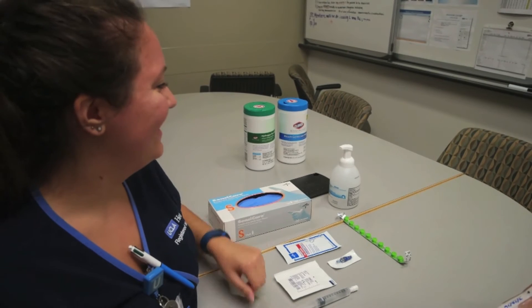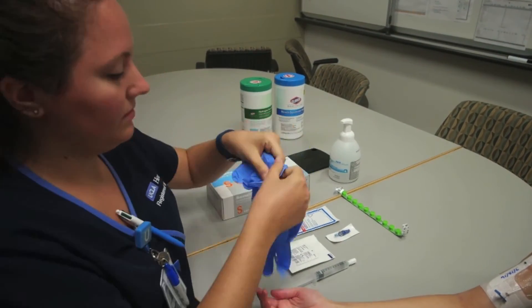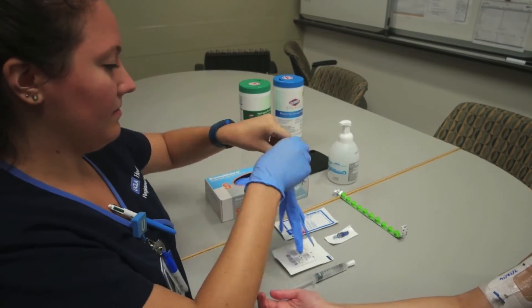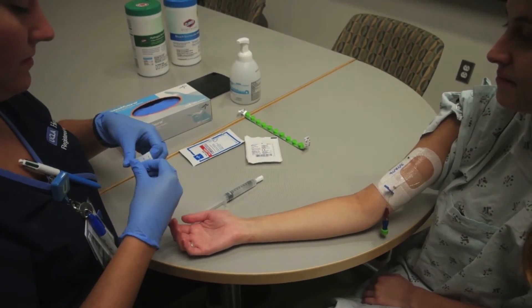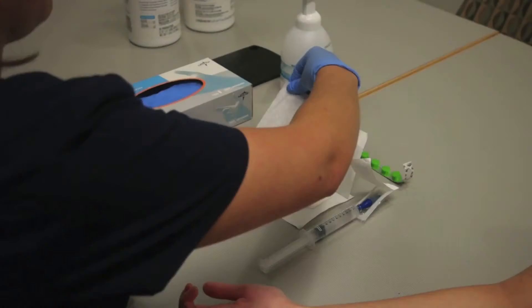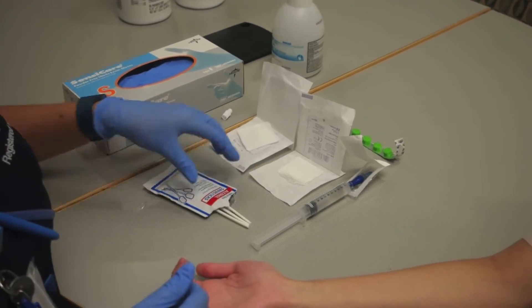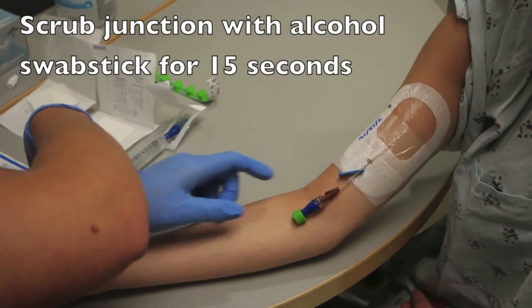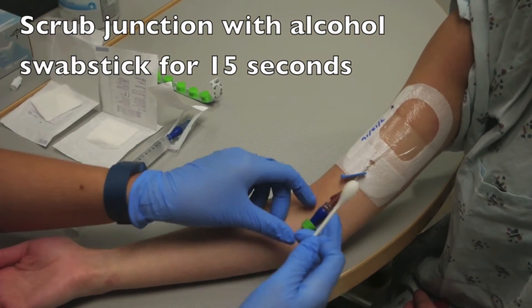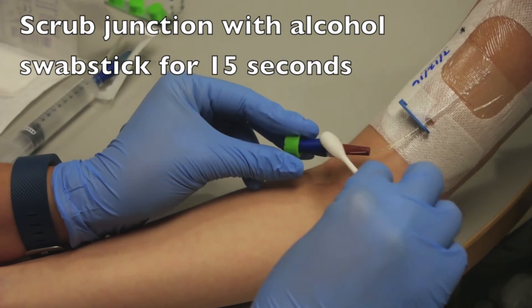And now we're going to demonstrate a CVC cap change. First, you're going to perform hand hygiene and then don your clean gloves. Prime your cap with a normal saline syringe. Open up the packages for your gauze and alcohol swab sticks. Now scrub the connection between catheter and cap outward in a circular fashion using one alcohol swab stick for 15 seconds.